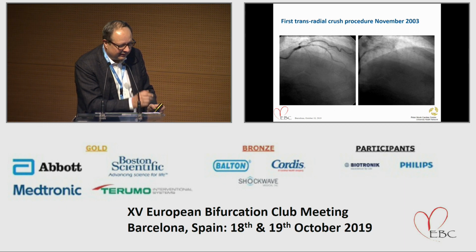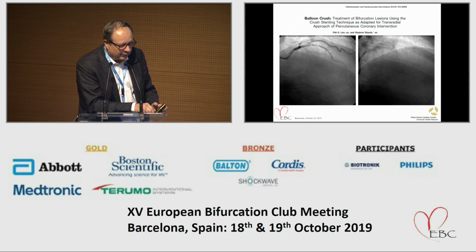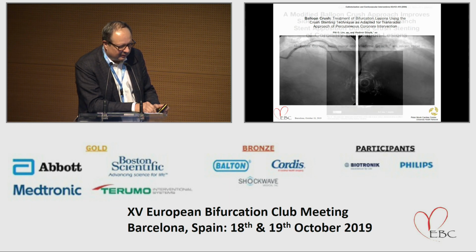So we were quite excited about this, but we were major transradial operators and 6 French, and this was done with 6 French, so therefore it was a balloon crush, which was, again, kind of a leap of faith. And I understand from Imad that around the same time he was already doing sort of a modified DK crush procedure with Shaoling in Nanjing. So we were kind of doing this in parallel.